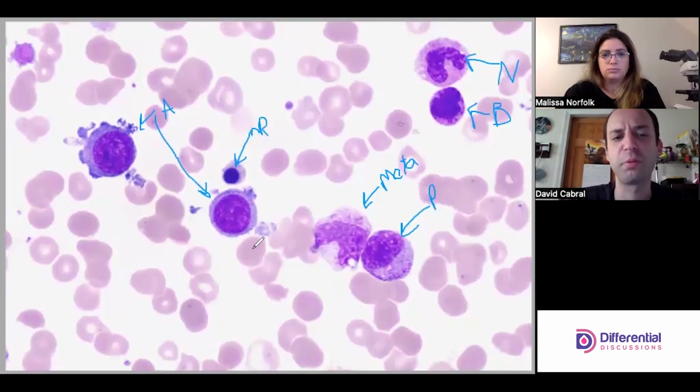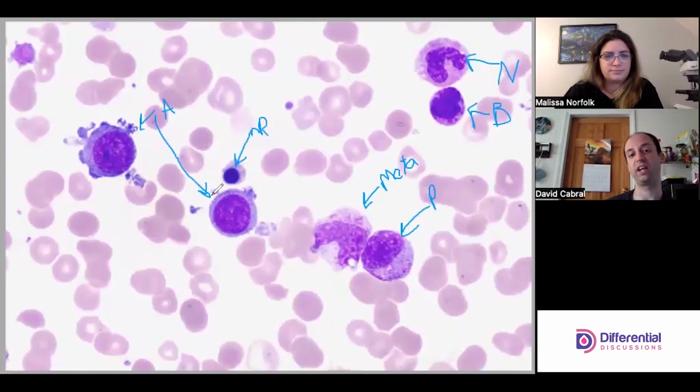Those blebs and the cytoplasm in that cell too, really, really dark blue. Very dark blue. Which is the interesting thing, because megakaryocytes aren't usually super basophilic except during maturation. So it's really funky looking. And then this guy looks more lymphy. But again, he's got weird little blebs coming off, and in all honesty, in a vacuum, if those two big blebs weren't there, you could probably just coast right by that cell and not even think twice.